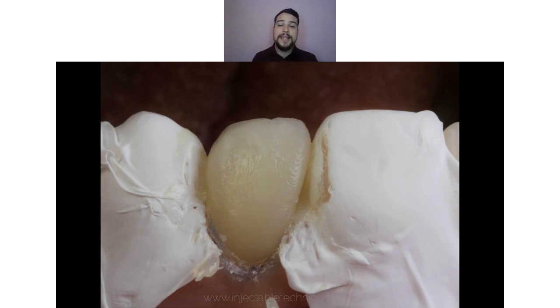The next thing that I want you to understand is to check the amount of the excess. There is almost no excess because the adjacent teeth are in full contour. I'm calling this the single veneering concept, when there is no empty space on adjacent teeth where the excess of the flowable composite can flow, because sometimes the excess of the flowable composite can be a problem.